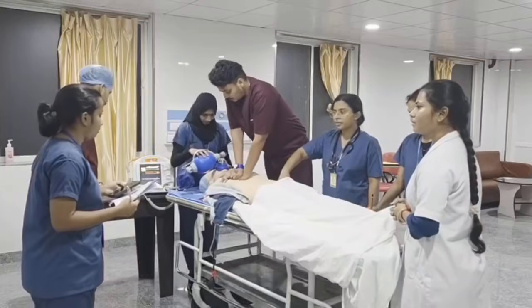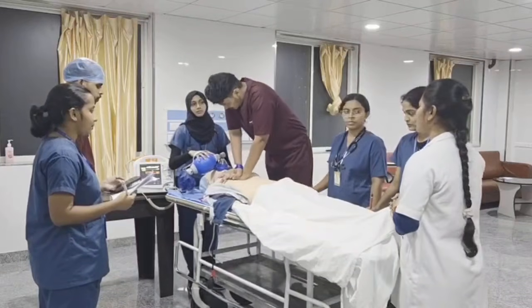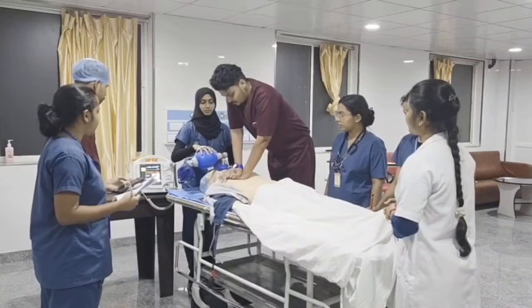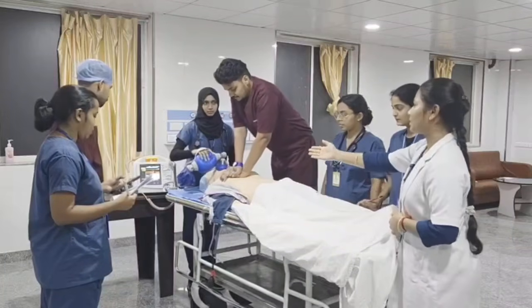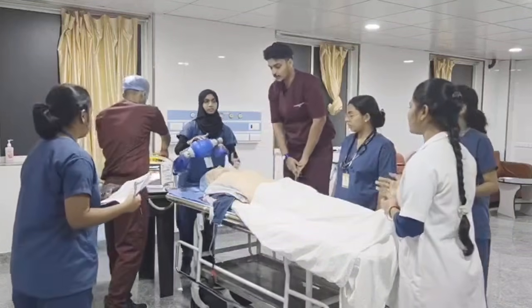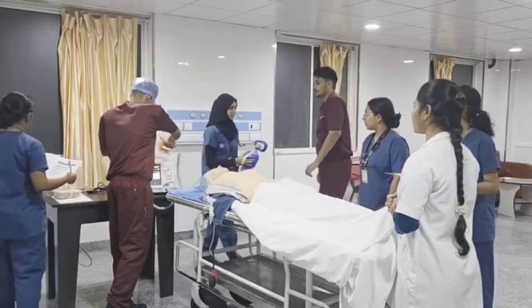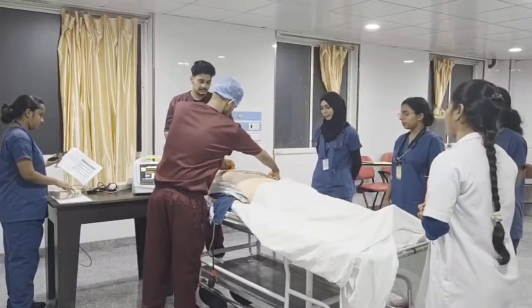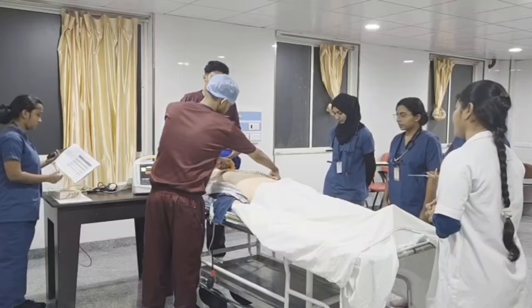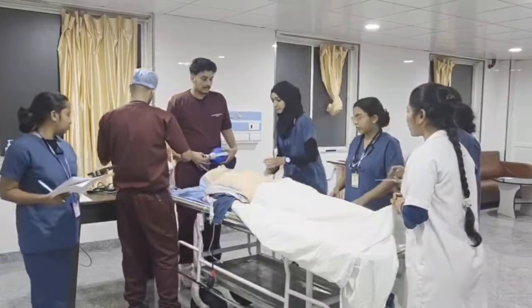Pulse is checked. 30. No pulse. Okay. The shock is charged. Okay. 2 minutes over. 30. You can deliver the shock. Meanwhile, you can switch over the compressors also. Deliver shock now. All clear. The shock is delivered. Okay.